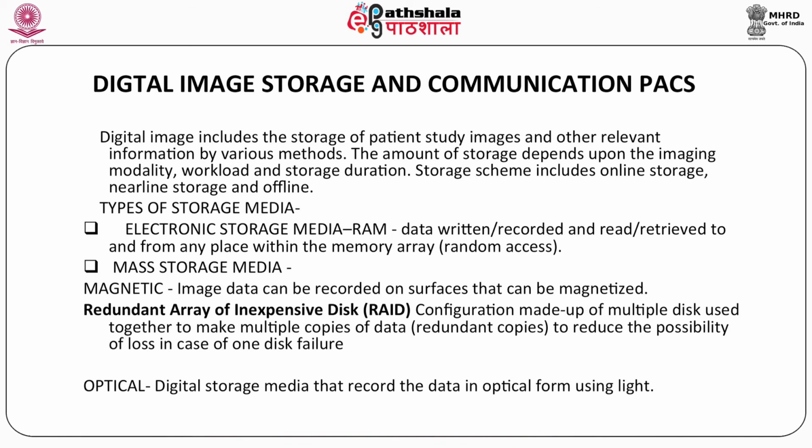But the disadvantage is that it has a limited capacity. Data, if lost, cannot be retrieved, for example if the disk crashes. If the image data is confined to a single disk, there is a possibility of data being destroyed in the event of mechanical failure, commonly known as a crash.